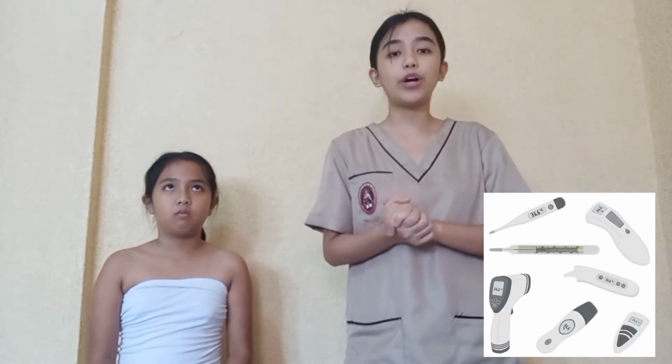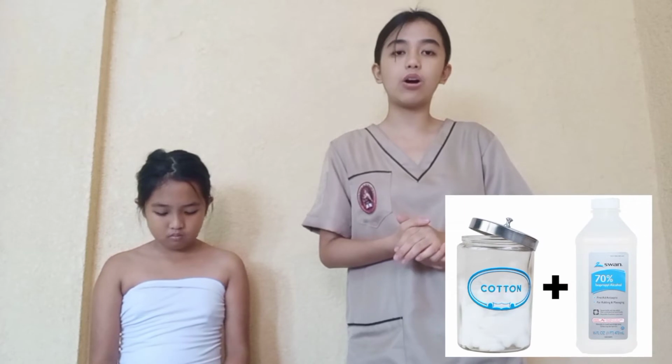So for the equipment, we will need different types of thermometers for the appropriate site to be used. Next, we will also need disposable probe covers if available. If not, use cotton and alcohol as an alternative, observing proper hygiene for the thermometers. We will also need water-soluble lubricant for rectal temperature measurement, non-sterile gloves if appropriate, tissue if needed, and pen and the medical record of the client.